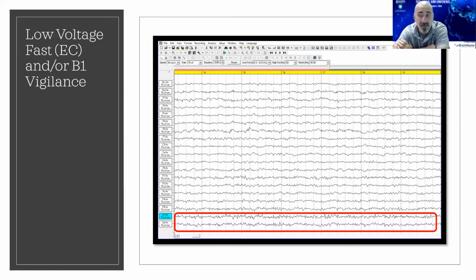One of the big takeaways here for the neurotherapy community is you really have to come back and read the EEG. You have to go back to basics and learn how to read the EEG. The maps are incredibly helpful in this whole process, but you don't want to just forgo looking at it yourself. For members of the medical community, whether they be psychiatrists or neurologists, I would encourage you, please don't go out and spend a fortune on software and think you're going to figure this out on your own. It takes years and a lot of mentoring and study to really make sense of what you're looking at.